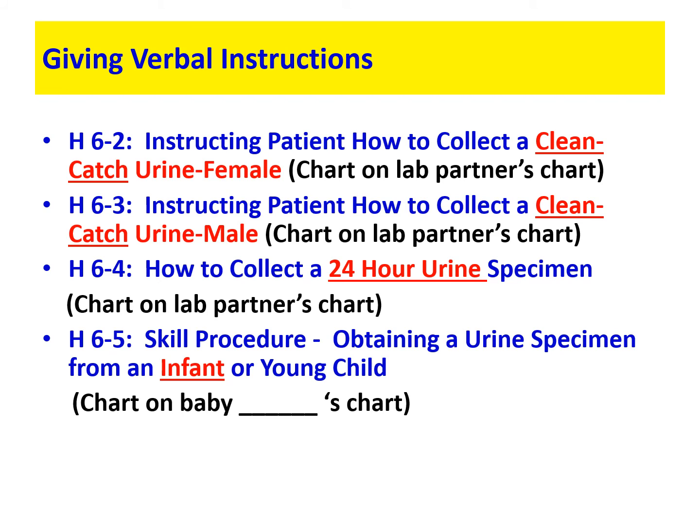And make sure the patient is comfortable when you're talking to them, okay? So make sure you check box all of those as you go through it. Read these boxes, guys. This is what we do every single day in lab, okay? And then go ahead and put your initials in 5 that you have performed all these things, okay? Then over on page 74, I want you to go step by step through 6, 7, 8, all the way down to your post-analytical phase of testing, okay? And make sure you read each and every one of them and check it off.